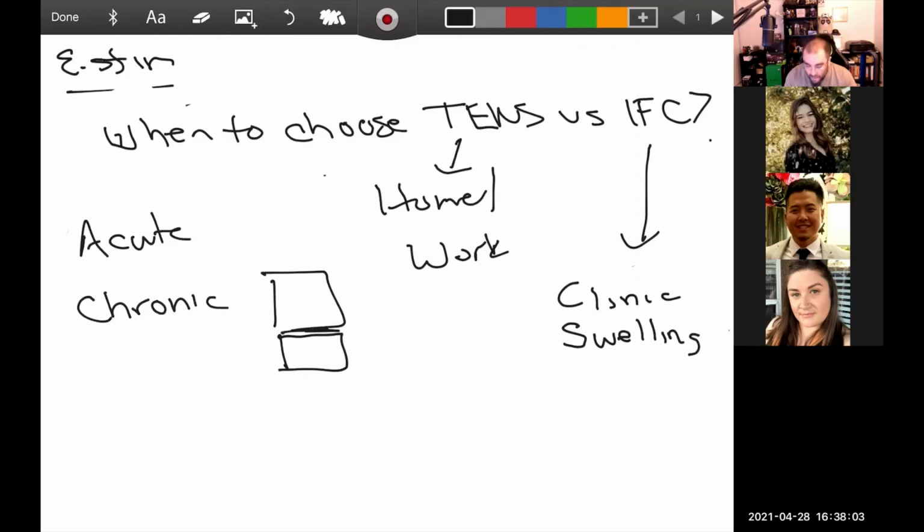You just can't put the pads where they're overlapping each other on any e-stim, because that can cause a short out. You don't want to do that. That can cause a burn. So if there's anything to watch out for, it's don't put your pads on top of each other. That's kind of like the Ghostbusters: you don't want to cross the streams. Same idea here.